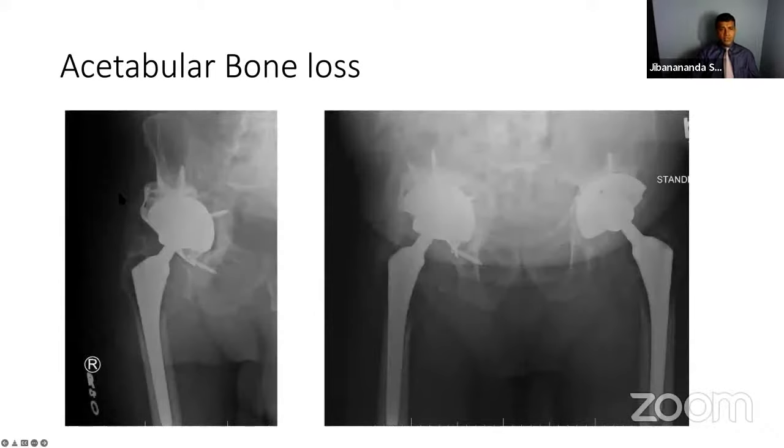So I used a DePuy cage. This is a lot stiffer. It normally has a flange. Many times I cut it out with a metal cutting burr, but keep a hole closer to the rim so I can have at least one screw. It's very difficult to position a cage when you have the flange up and down, and it really adds a lot of time. So I would use this when I have some bone stock at the rim available. Then I would cut the cage at the bottom and use a screw at the bottom. Obviously the top part is a little fiddly too, but that's something you learn with experience.